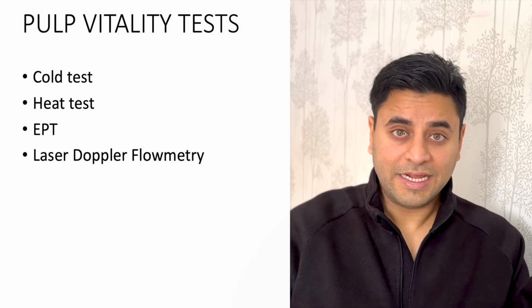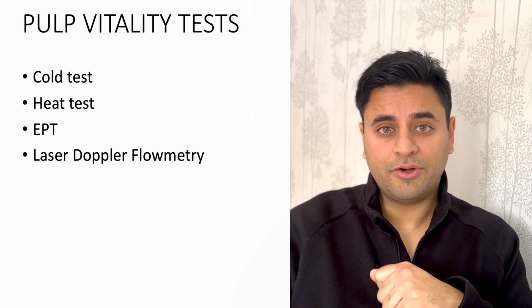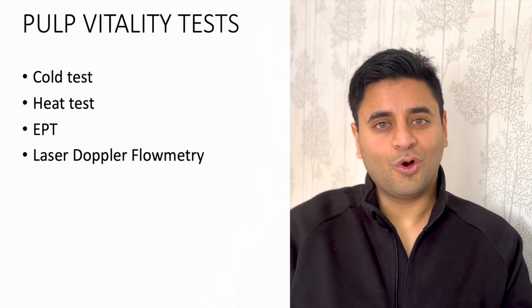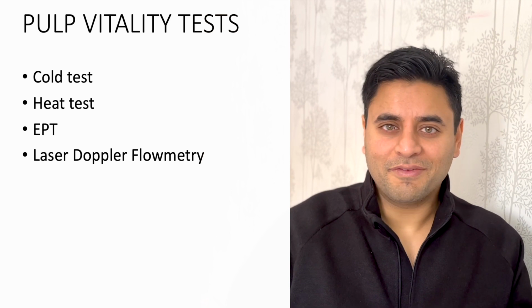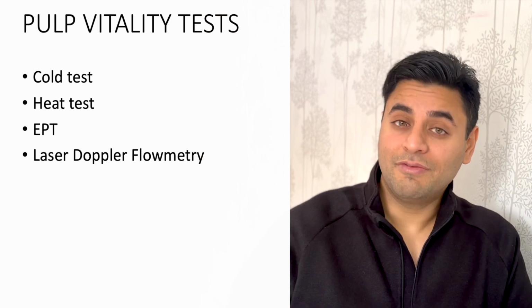Out of these 4 tests, the most reliable, actually 100% reliable test is your laser Doppler flowmetry test. But that's not practical. That's not something that we have in the clinic. That's why it's not useful. But somehow our dental board exams and our competitive exams love to ask questions on this laser Doppler flowmetry test. So for the sake of that, we will include this in our lecture.